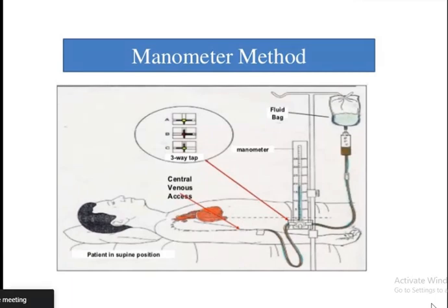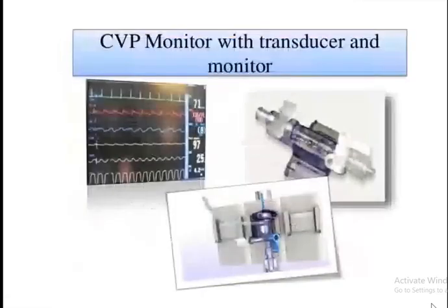So rest all things are same. And this is with the help of the transducer. Here in the picture you can see that this is the transducer with the stopcock.